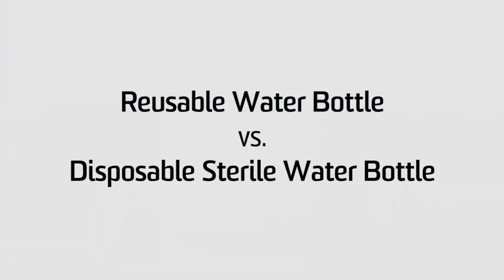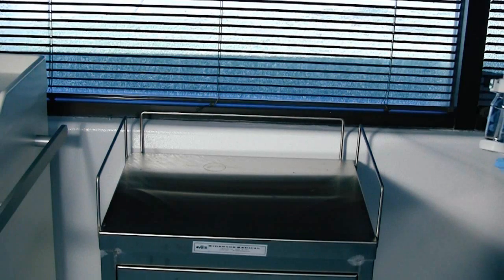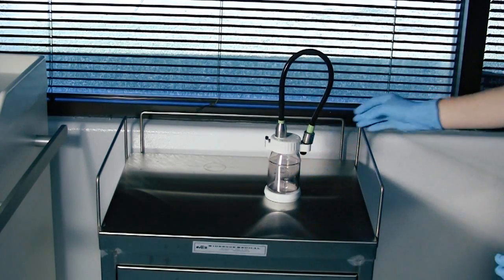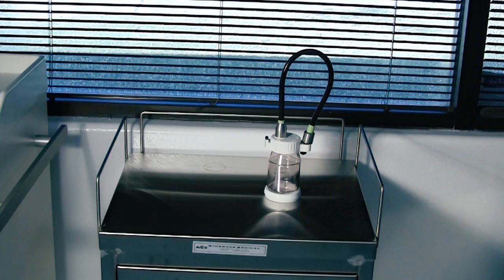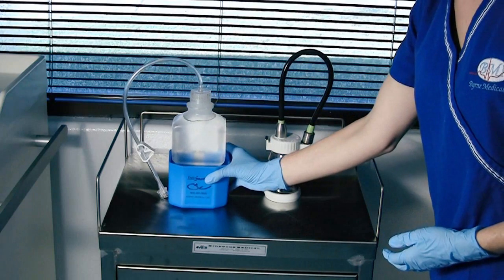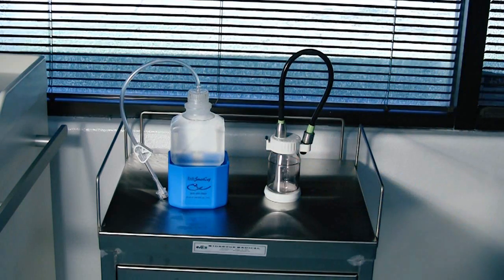The Smart Cap is designed around the Predicate Reusable Water Bottle, which is offered by the various scope manufacturers. Seen here is an Olympus water bottle designed to be used in conjunction with sterile water and any Olympus scope, 140 series or newer. Next to it is an Olympus Smart Cap prepared with the sterile water bottle. Even though one version is reusable and the other disposable, both products perform the same task: providing air and water for an endoscopic procedure.